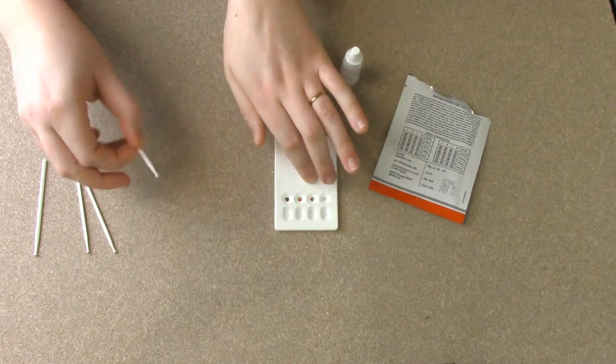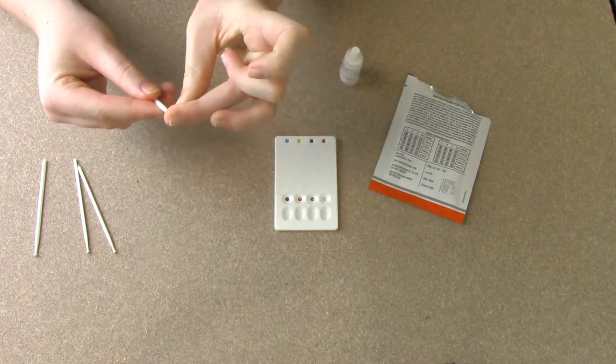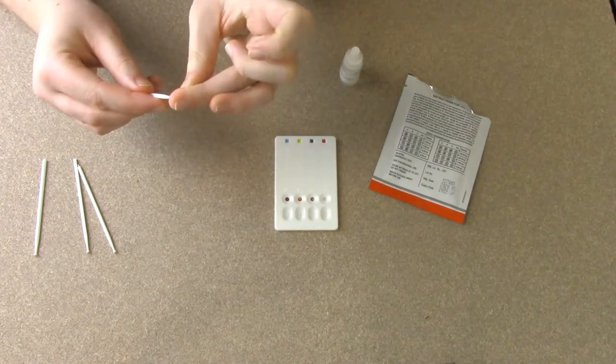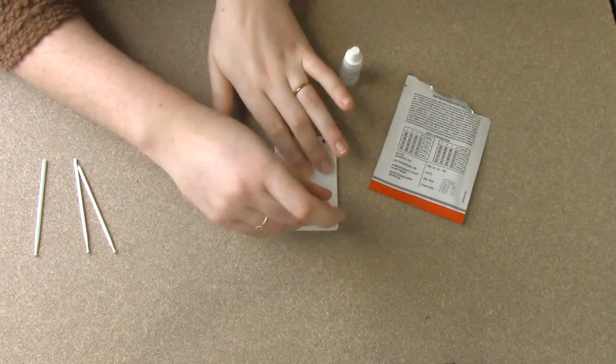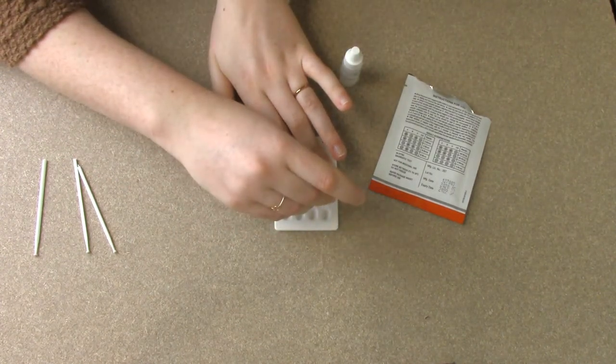And the very last one in row S is our control which is important. It's just going to allow us to know if we did the test properly. So make sure you get some blood in that control well.